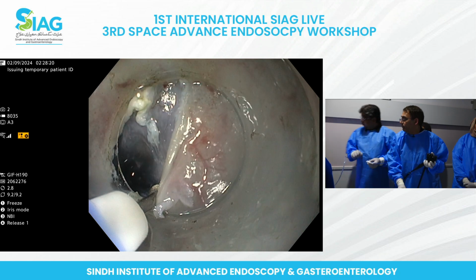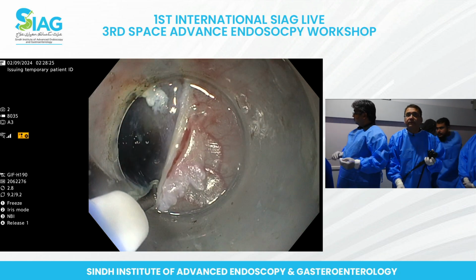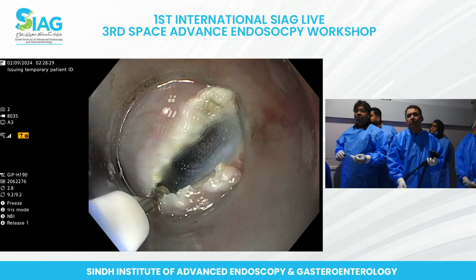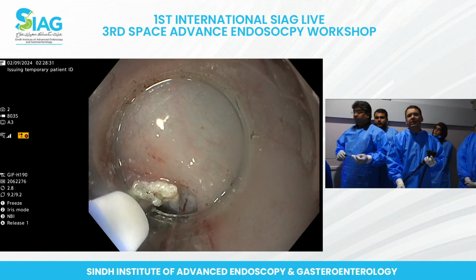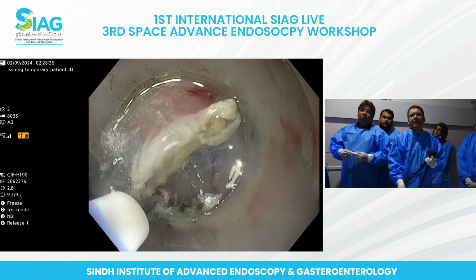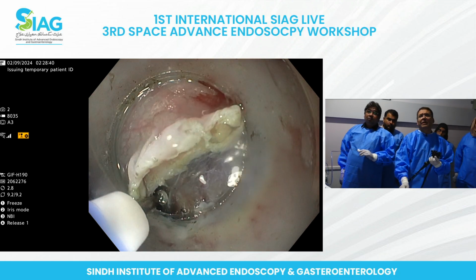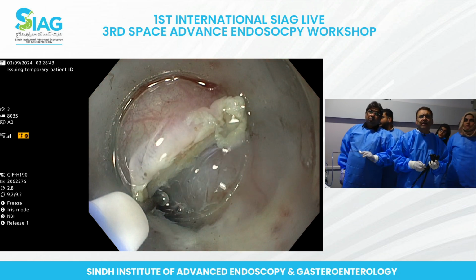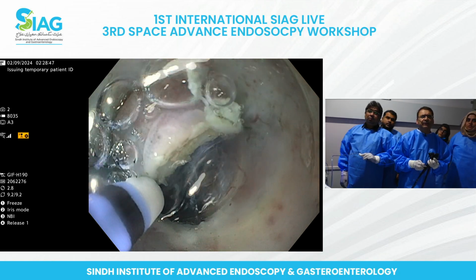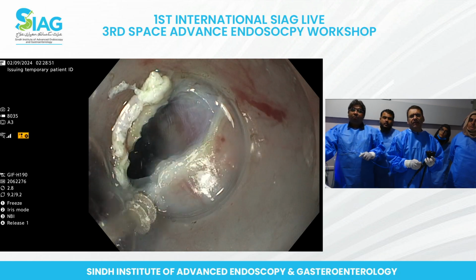Go on top of it. Press the tunneling and myotomy one. Yep, okay. So I'll just trim a little bit from inside, so I can create a space for me to be able to put that cap scope in. Here I'll push that knife a little bit in and inject. You see that injection? It's just up with the foot paddle. That's why I like this RB jet.